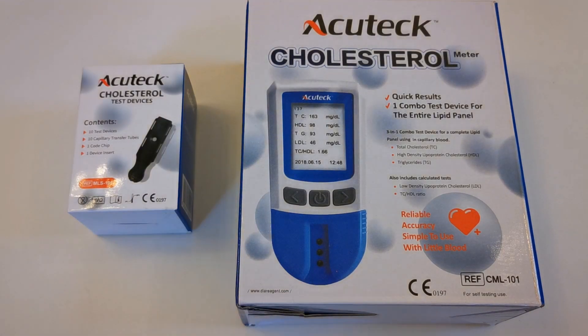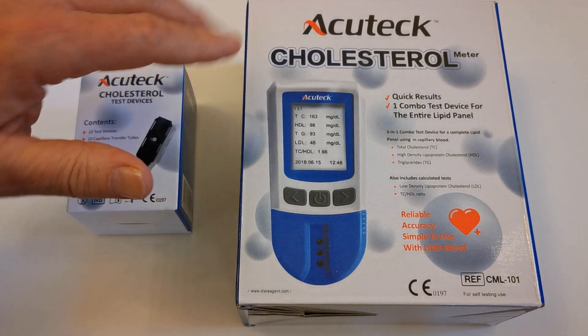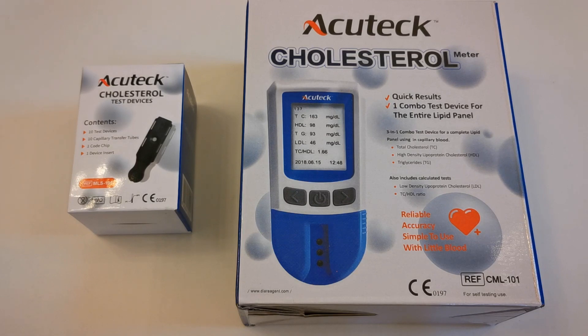Welcome to this Valumed presentation. We're going to show you the 5-in-1 cholesterol meter. The branding that we're using for the demonstration is Acuteck, but this applies to the EcoTest meter that we're selling here in the UK.